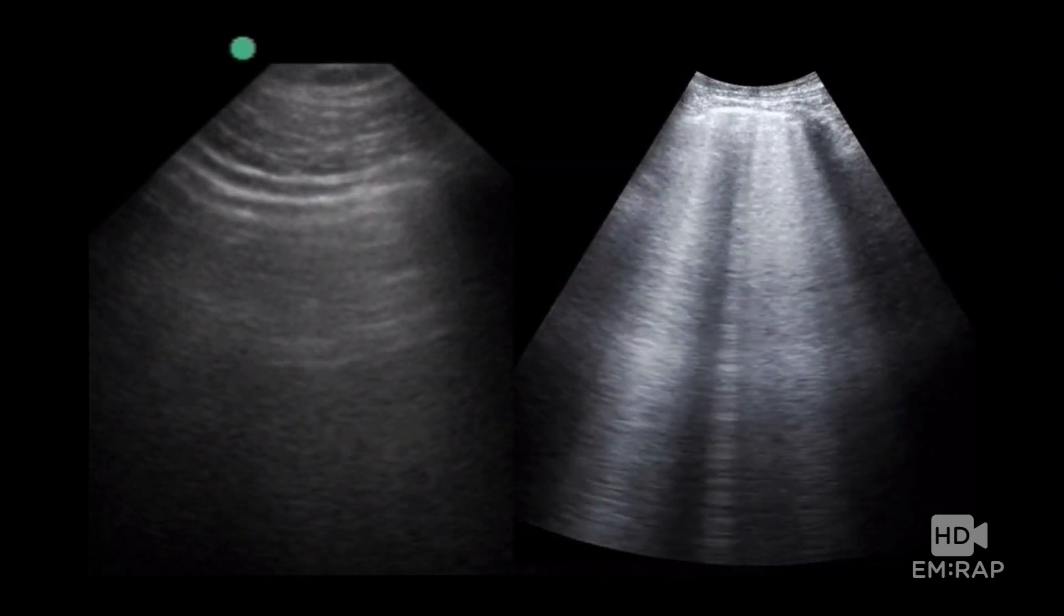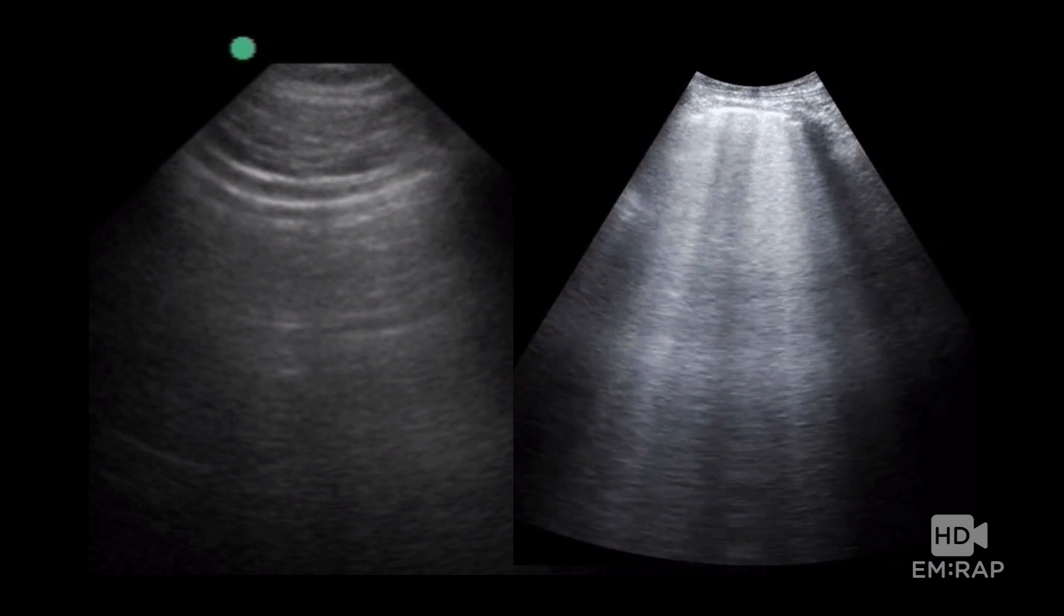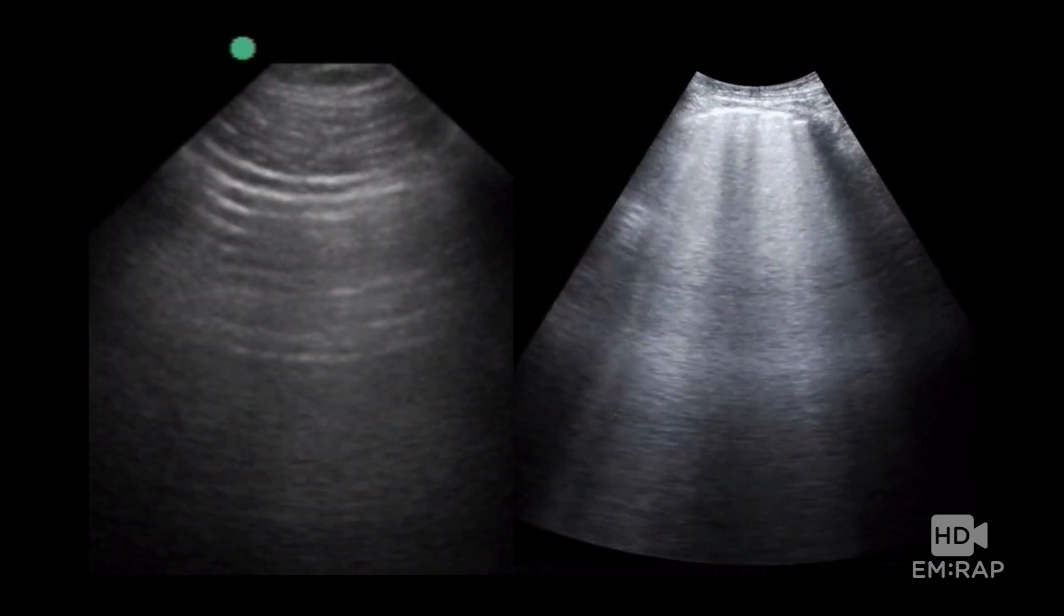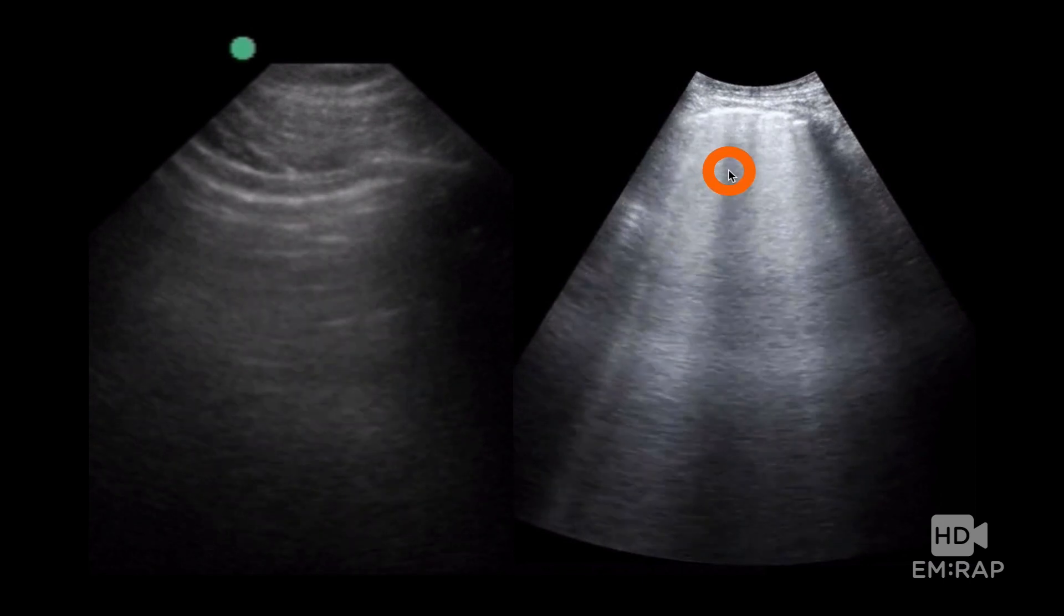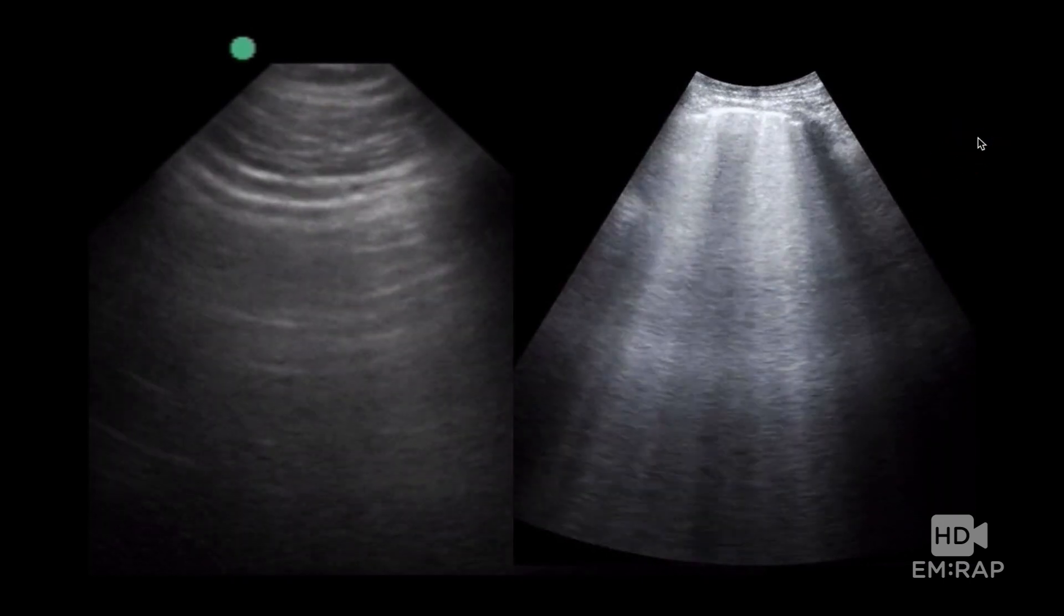Need those side-by-side? Here are two other examples. The clip on the left side of the screen doesn't have pulmonary edema. The one on the right has pulmonary edema. Here you have horizontal artifacts, A-lines, and here you have vertical artifacts. These are called B-lines.